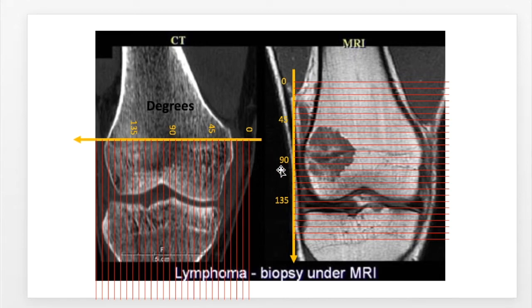Furthermore, you can use a straight radial system, as I did for the normal colon and the serrated colon, and that baseline coordinate system can be really arbitrarily placed too. Again, it depends on what you're trying to measure, and whether it makes sense. In this case, on the right, we're measuring the contour of this tumor starting from the left side as the base.